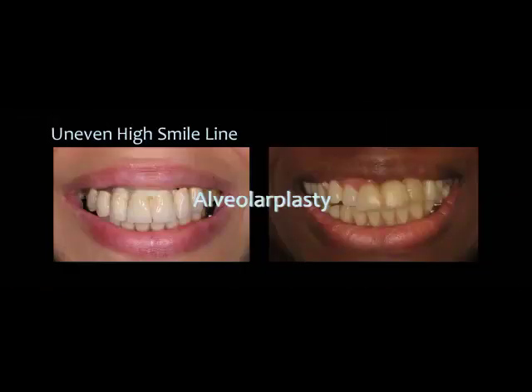So what do you do when you have a high uneven smile? Okay? These types of cases follow a different type of protocol. We need to always analyze the patient's smile. Again, Dr. Weber emphasized in his lecture that the smile is critical. And we have to create the margins of our prosthesis to be out of that smile zone. So what's going to be indicated is alveoloplasty. This is when it's indicated.